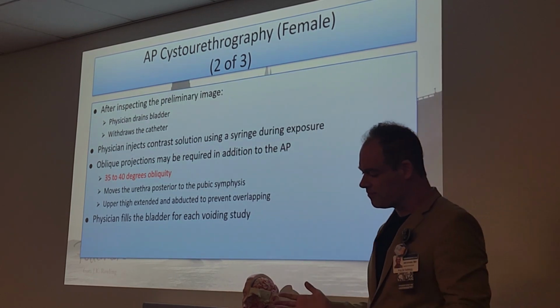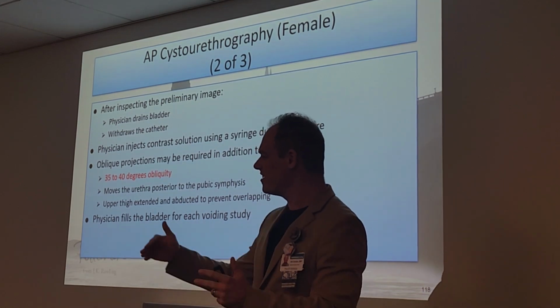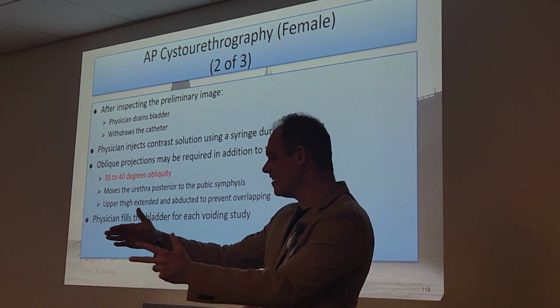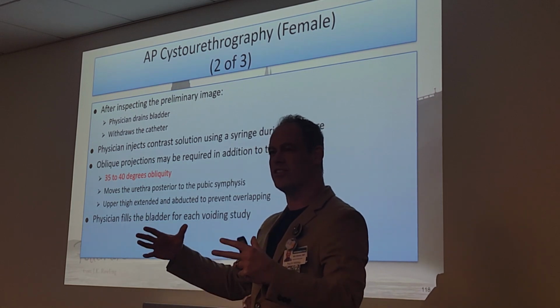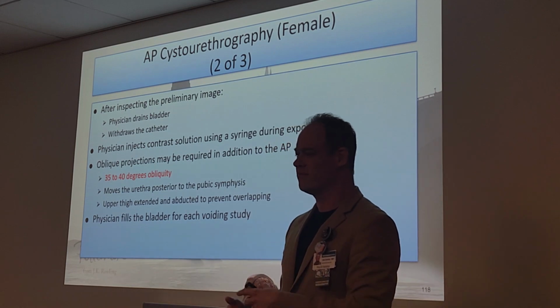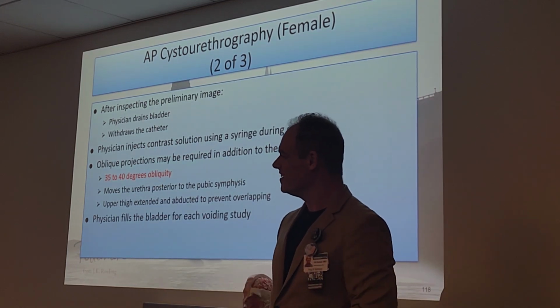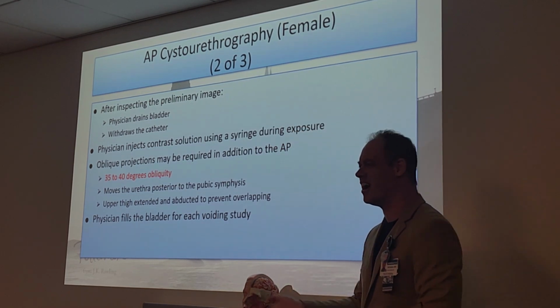So what I do, I always make like a little fort, a towel fort around the patient. I call it my towel fort. I encircle the patient with all the towels. That way when they're peeing on the table, it kind of just catches it all as it makes the puddle. And then I just wipe it up when they're done. You look all disgusted over there. It's just contrast coming out.